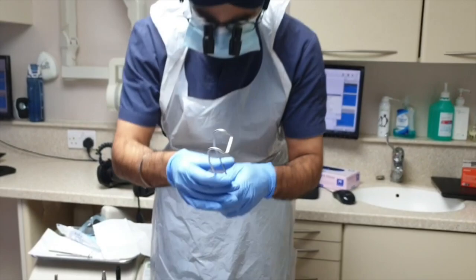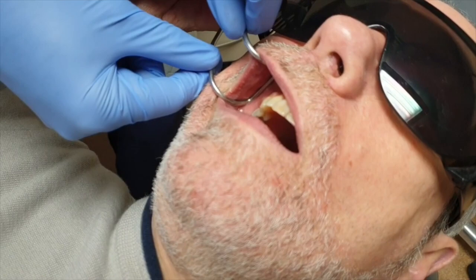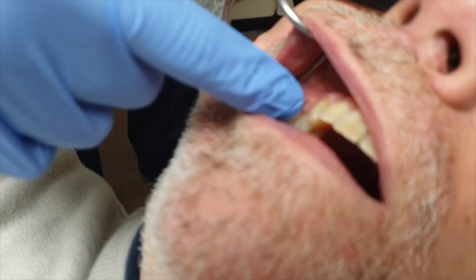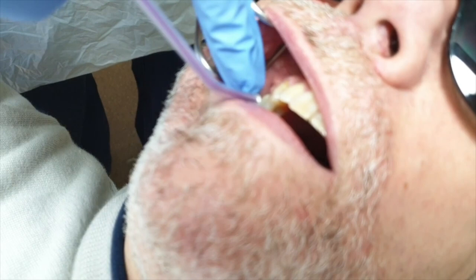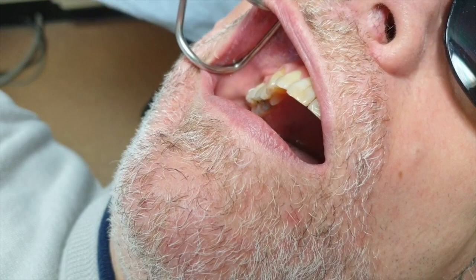I've got a lovely patient, Mr. Petit. My nurse is recording so Mr. Petit is going to move his lip over to the side. The trick is to keep a distance between the buccal surface of the tooth and the cheek — and you've got a perfect situation there. Next thing to do is to dry the teeth. Open nice and big — keep it nice and dry. Now it's good to sometimes warm your mirror because it will steam up.